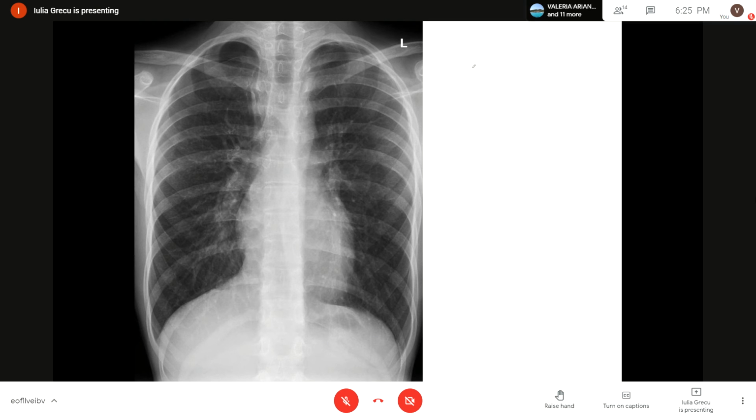You suspect a pneumothorax in one of your patients because, I don't know, he has a sudden chest pain. He's a person that smokes, that might have a chronic pulmonary condition. You think that he might develop a spontaneous pneumothorax, and you get the chest X-ray that is not quite specific. Maybe you're not quite sure whether there is or not a pneumothorax. What would you do next?